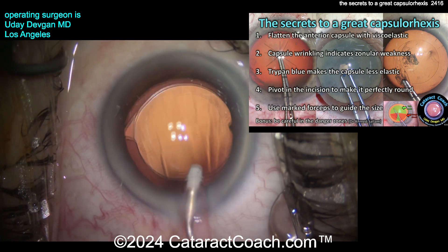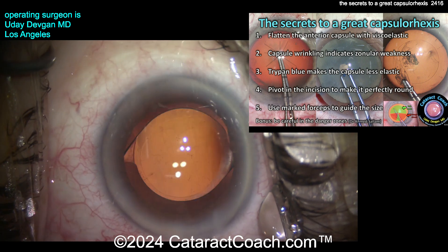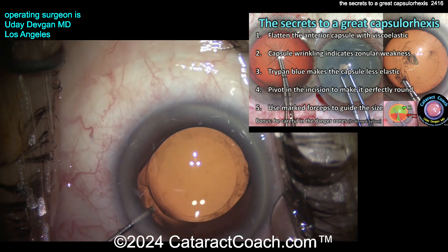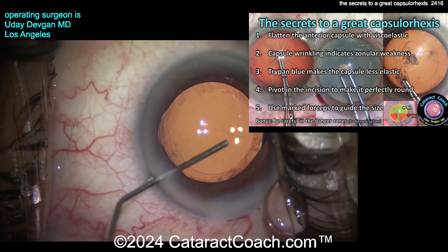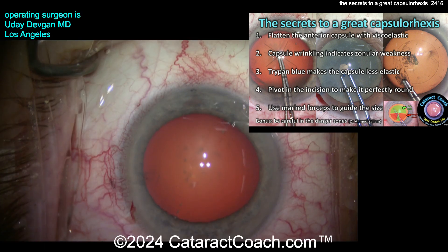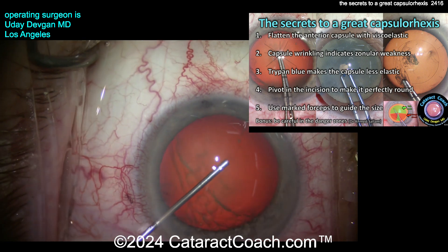Let me tell you about these secrets. The secrets to a great rhexis are: flatten the anterior lens capsule with viscoelastic — we talked about that already; capsule wrinkling, which indicates zonular weakness — I'll show you on the next case; trypan blue dye is great but it makes the capsule less elastic — I'll show you that; you've got to pivot in the incision to make it perfectly round; and of course I use these marked forceps to help me.